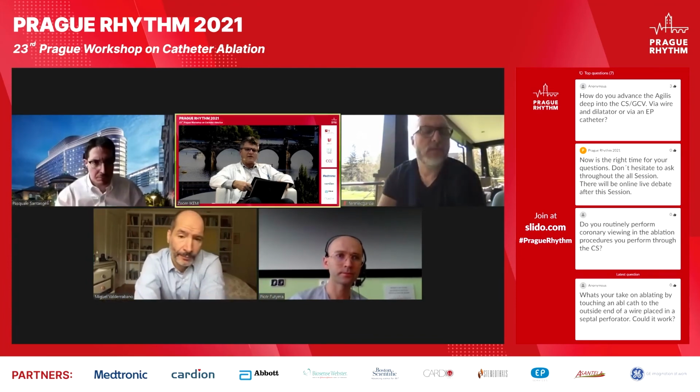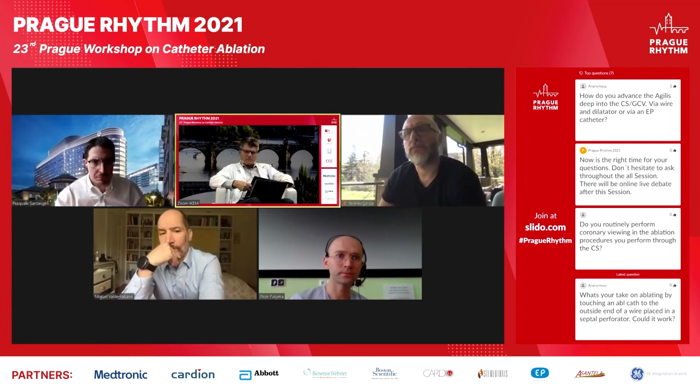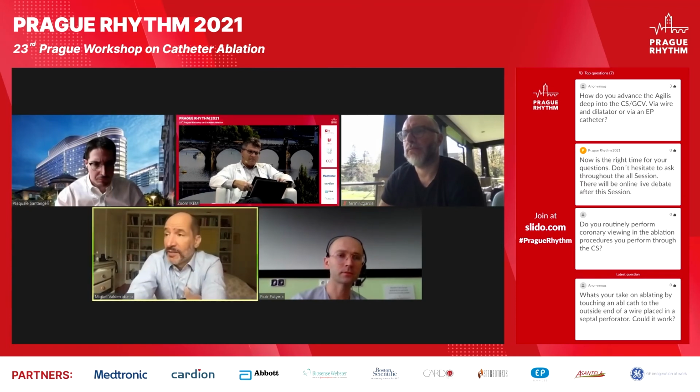Yeah, thank you. And there is one more question, which can be probably answered by Miguel as a last question. How do you advance the Agilis? You probably don't use Agilis, but how do you advance the Agilis deep into the great cardiac vein, by wire and dilator or via an EP catheter? It is probably in terms of safety. I use Agilis or probably whatever cheaper. I don't think the flexibility is necessary, or it's useful, but I don't think it's crucial.